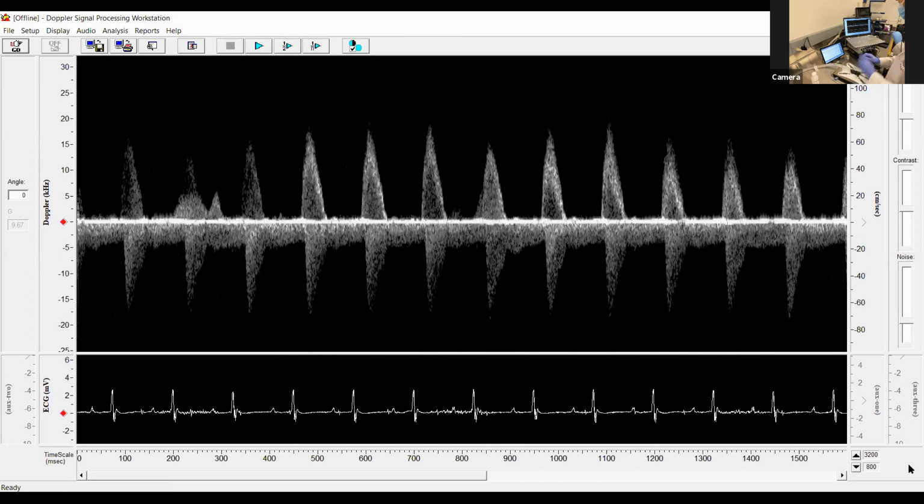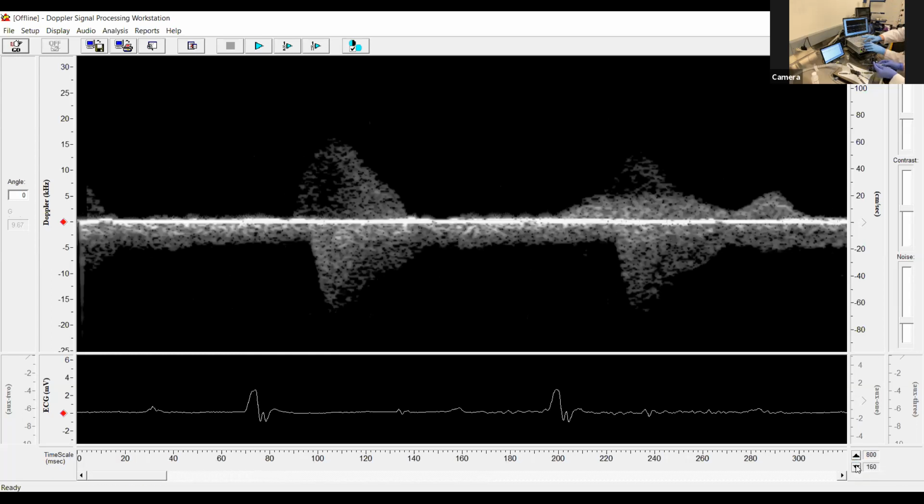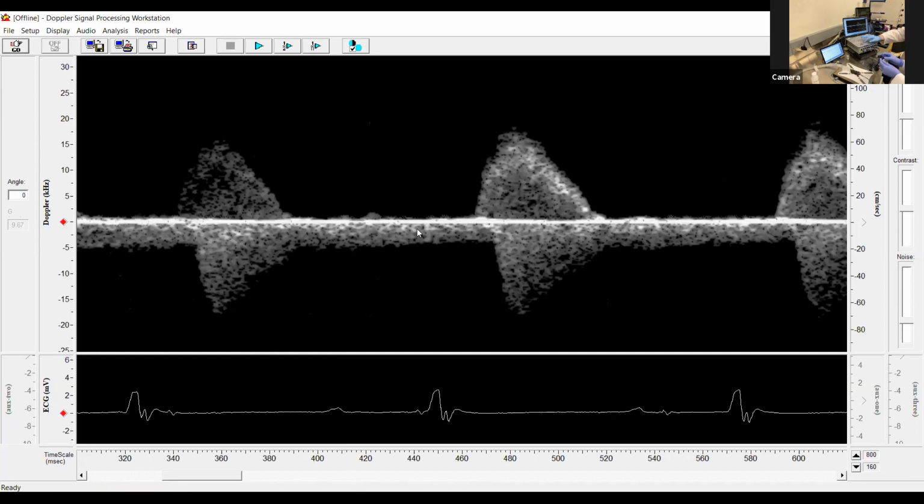Yeah, that one's nice. Yeah, perfect. So then we can zoom in on it. You can zoom in really nice and far, and I'll zoom over. So here we can see really clearly that measurement. So you would start the measurement here and go to here. I don't know if you wanted to show that time measurement, just so they can see how small a time gap that is. Just make a quick time measurement there.